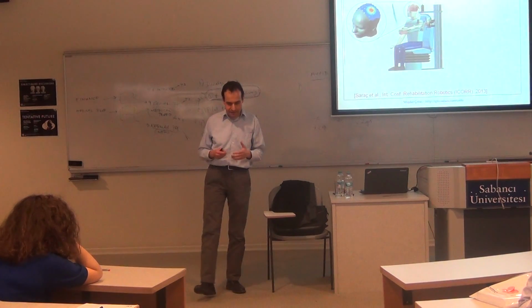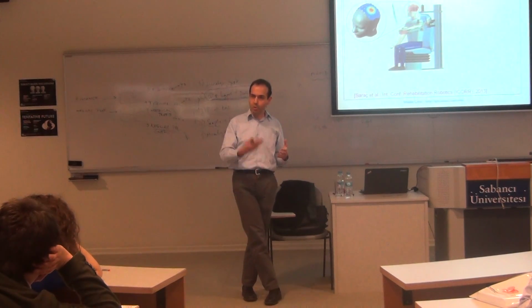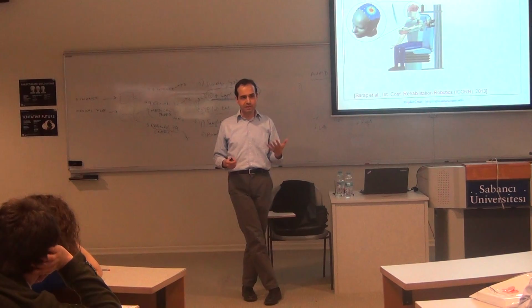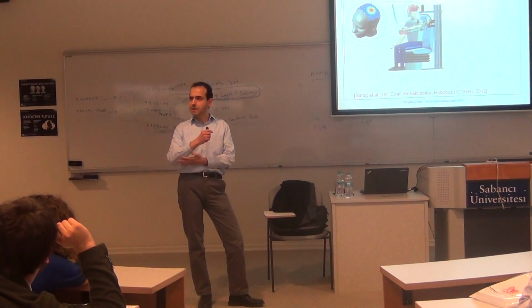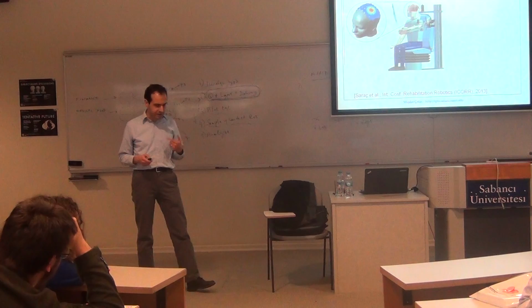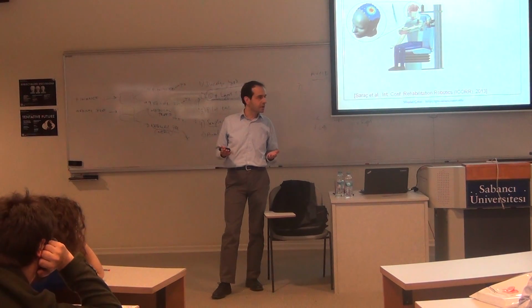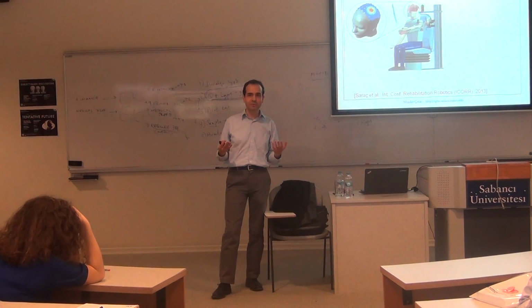The idea is the following. The belief is that in a rehabilitation protocol, if you get the patient more involved in the task, the rehabilitation is usually better. And in conventional approaches, they try to measure the level of involvement of the patient by measuring forces applied by the patient, etc., using various types of force sensors. However, think of a subject who suffered from a very terrible stroke. There is no residual motion. So you cannot measure anything about the level of involvement or intentional participation of the person.